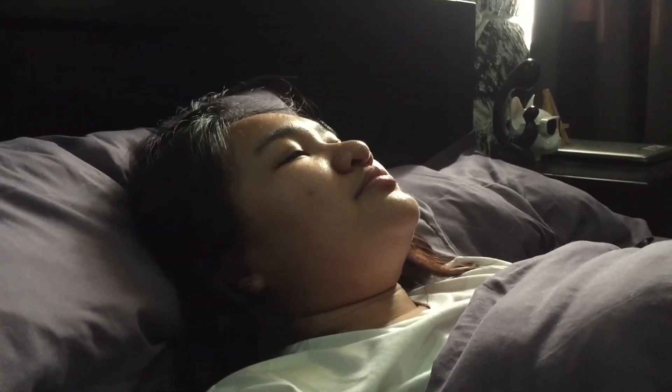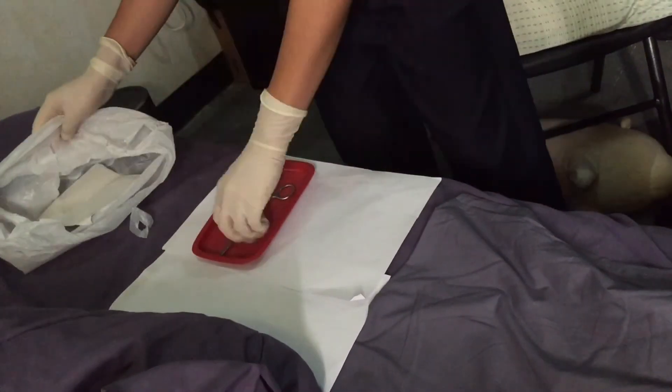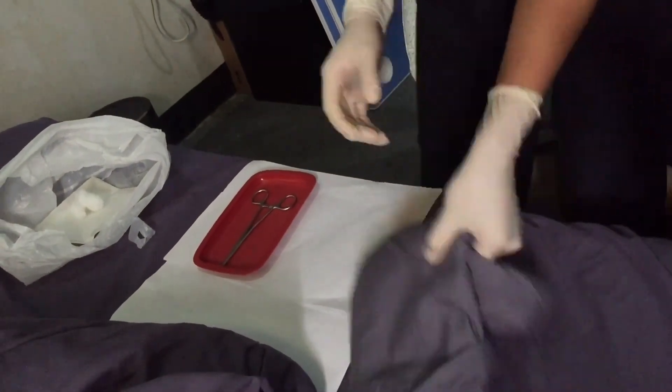Assess the patient and provide comfort. Then discard solid materials.